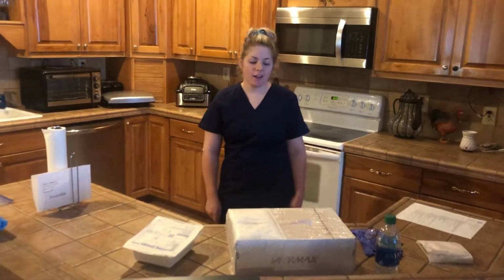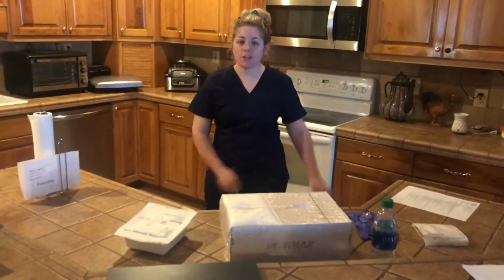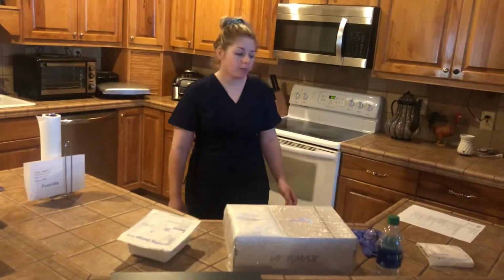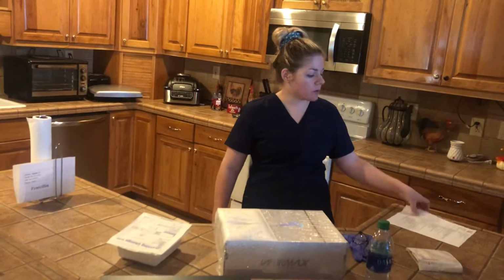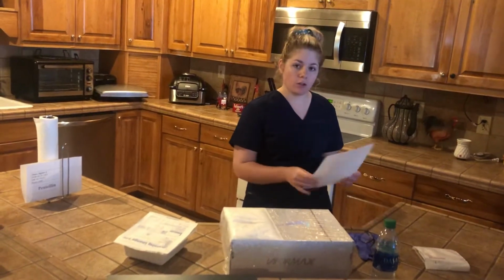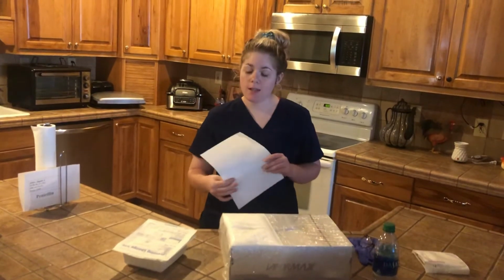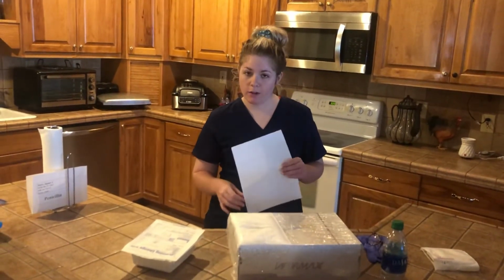Is Shane Kelly. I'm a student here at the College of Nursing, and today I will be performing a wet to dry dressing change. First, I will get my patient's orders and verify the orders to do the dressing change. I will then verify my hospital's policy and grab all the materials that I need before entering the room.